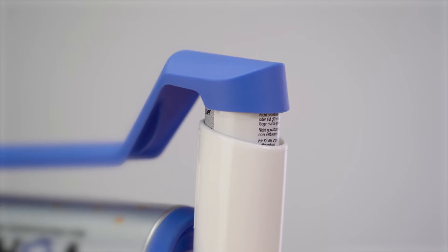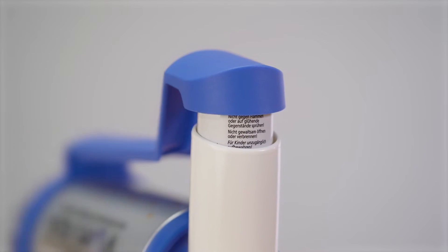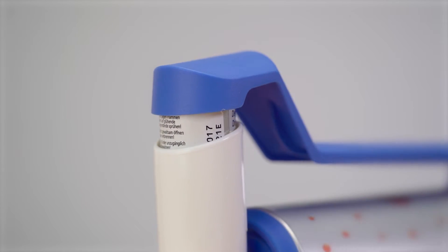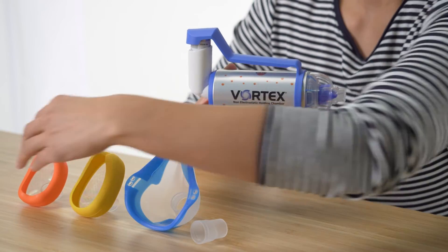If using the one-handed operation aid, position the round end so that it encompasses the metered dose inhaler. If you need a mask, connect this to the mouthpiece.